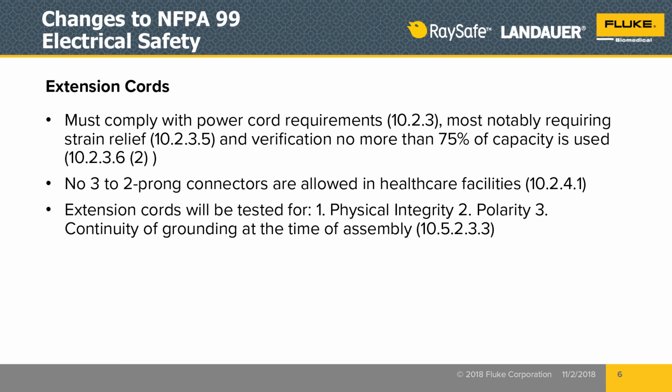Extension cords are a great topic. Everybody loves talking about extension cords. They're often a trip hazard and often unsafe. We don't want to be going and buying the cheapest possible thing for use in a hospital, of course. There are things in NFPA 99 that were also clarified in 2012 and newer, calling out that the power cords for dealing with extension cords are treated just like any other power cord.